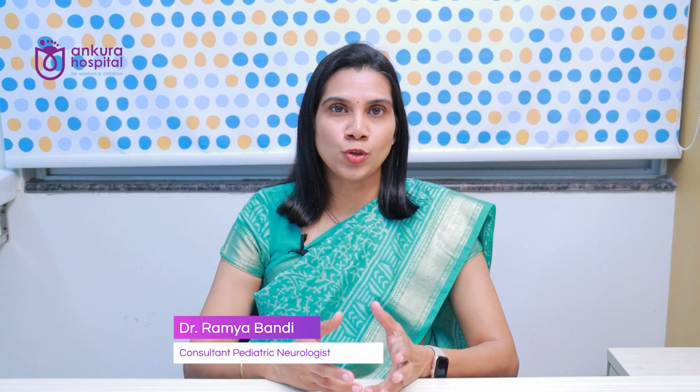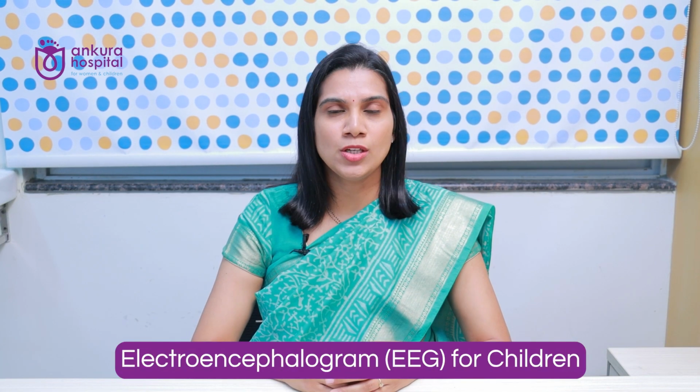Today we are going to talk about EEG. So EEG stands for Electroencephalogram. You all might have heard about ECG, which is done for the heart. Basically, in ECG what we check is the electrical activity of the heart. So similarly, in EEG we check the electrical activity of the brain, which tells about the functionality of the brain. MRI brain will give us the structural details, whereas EEG will tell us about the functionality of the brain.